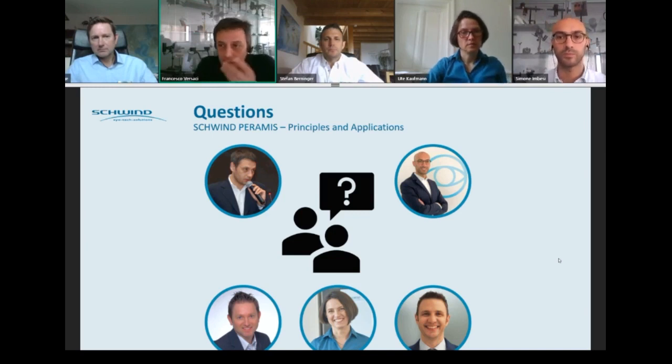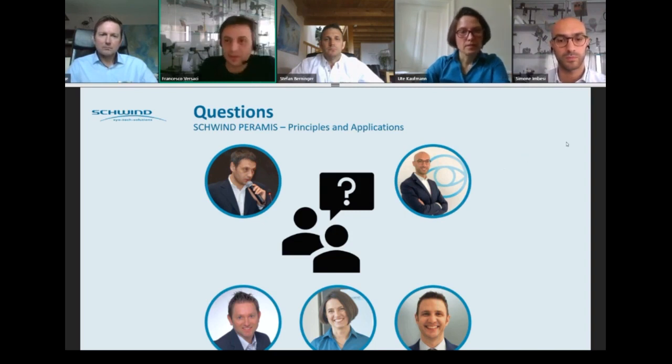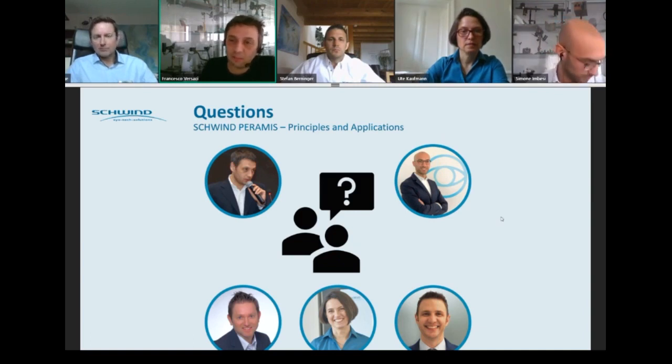But if the removal of a Zernike coefficient has a big impact on the simulation of the PSF, this is something that we might plan to remove. Then there are other aspects that you have to discuss on the other side. So how much this impacts the depth of the treatment. But optically speaking, you just check how much is the impact on the PSF.